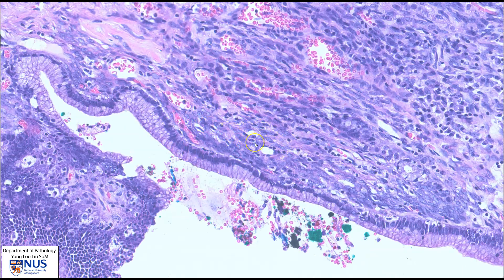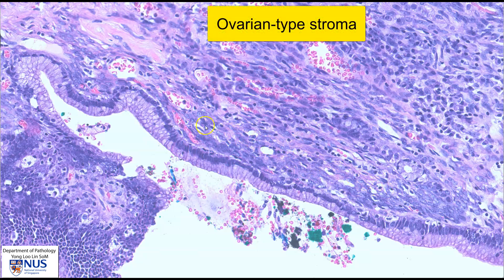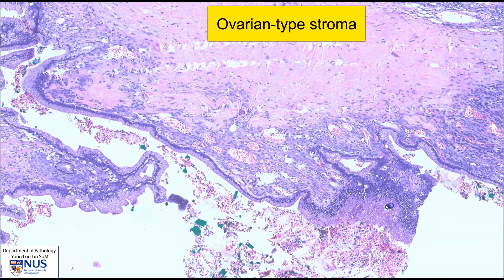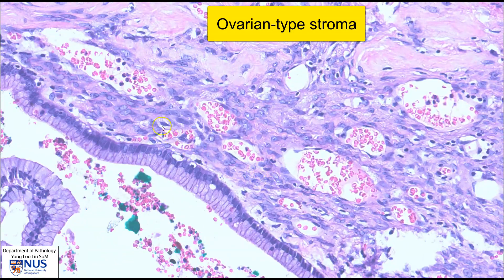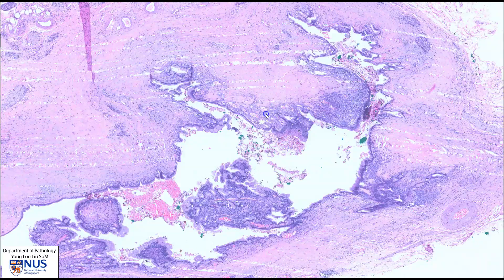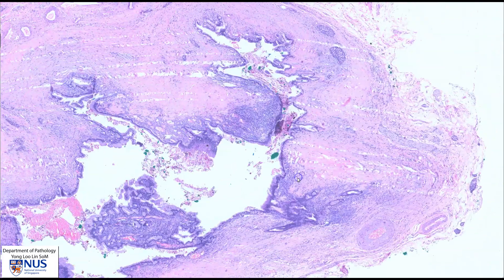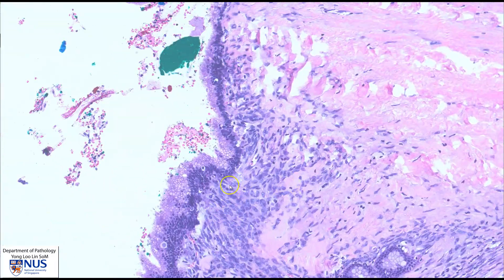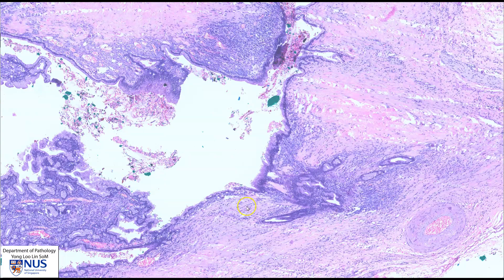There is another feature that is demonstrated nicely here. Just beneath the epithelium, we can see a very cellular spindle cell stroma. This stroma resembles normal ovarian stroma. We can see the spindle cell stroma in other areas as well, and it is well demonstrated in this region. This ovarian-type stroma is very classical for mucinous cystic neoplasm.